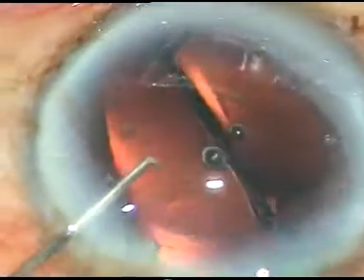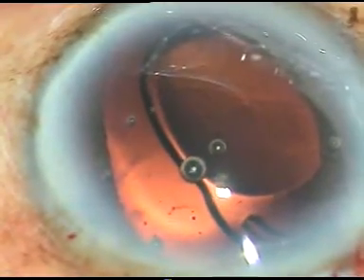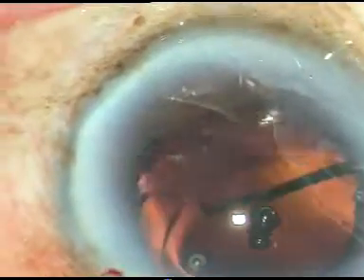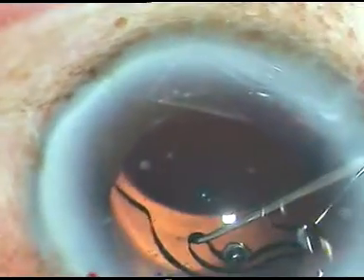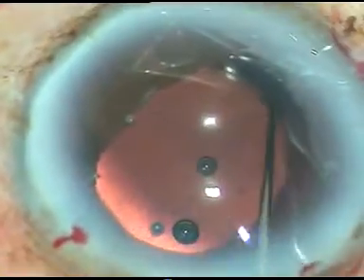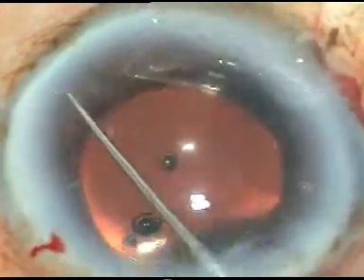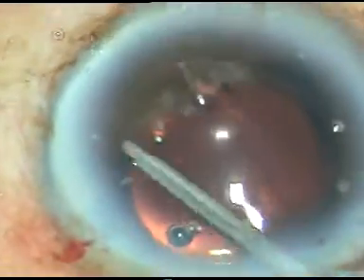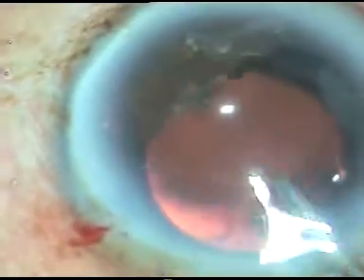The leading haptic has not gone into the capsular bag, so I depress the leading haptic and place it in the capsular bag. I dial the lens and at the same time push it back, placing the trailing haptic also in the capsular bag. Now the viscoelastic substance is being irrigated out.